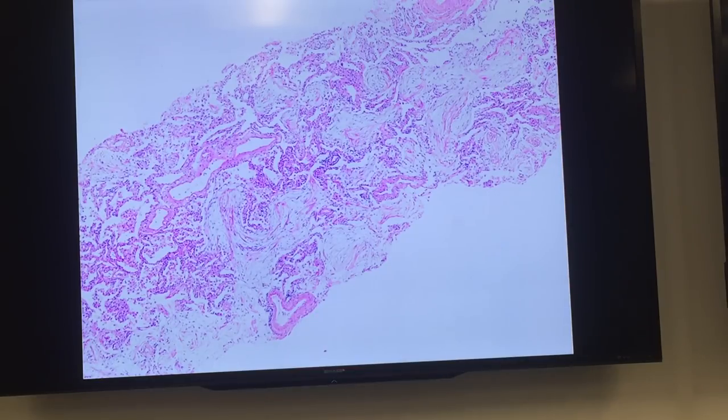It's following the contours of the alveolar spaces, like one corridor to the other one. Look at this one. I can almost trace it from here, goes into another one, expands, constricts, expands, constricts, expands. Right? So it would make sense that it's within the alveoli. What else can we say? Are there bronchovascular structures nearby? Yeah, there's one there. There might be one up there.